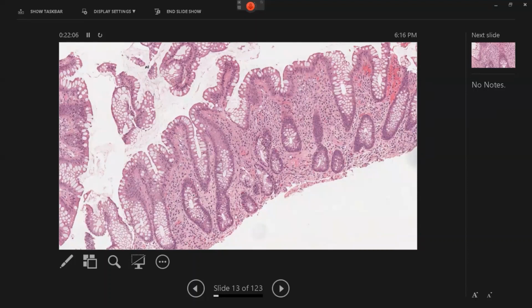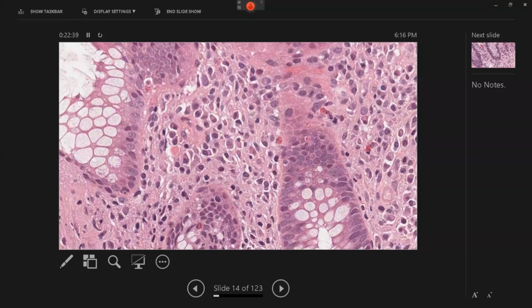So this is another example of how sometimes the inflammatory cells alone, or the graded inflammatory cell infiltrate, can deceive you. That definitely can deceive you, and you miss what might be on the surface just because you focused so much on the inflammatory cell infiltrate and you are not trying to address the other protocol of assessment.